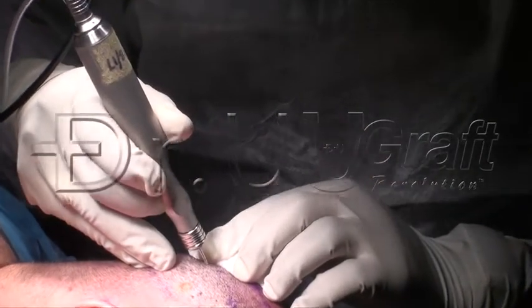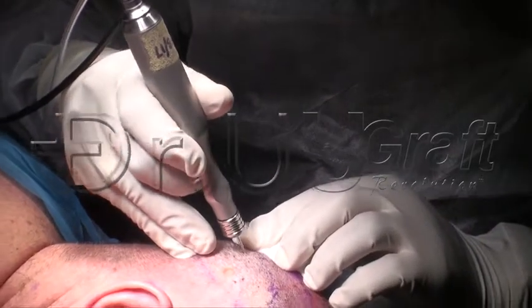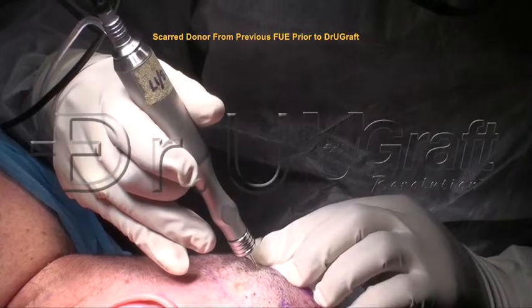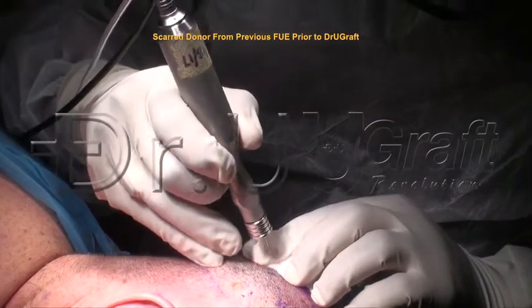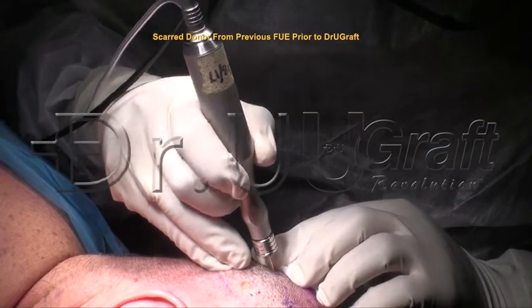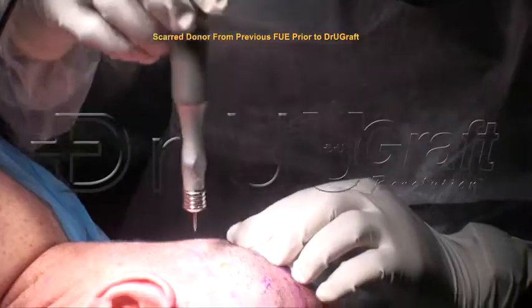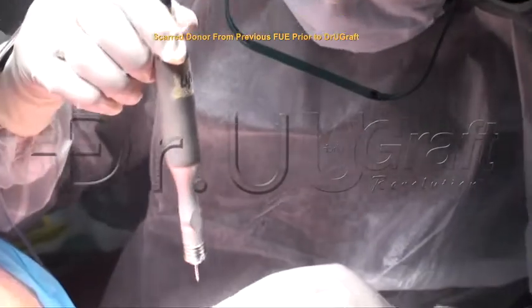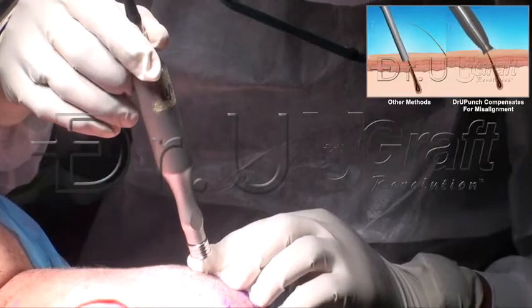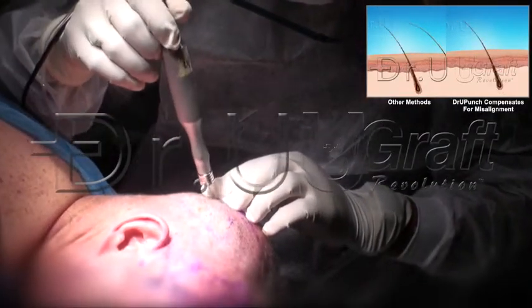Even a person with no skill can use this. This patient has had FUE, and the area is scarred. That's me holding it — and we just want it to release.